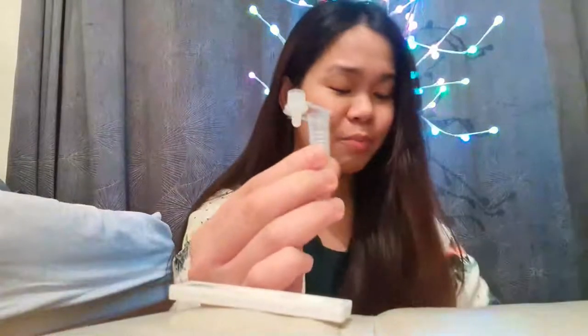Five, six — there you go. You can probably ask someone to hold this for you while you swab yourself, or leave it somewhere safe so it stands up and the solution won't spill, keeping the top bit sterile as much as possible — which I've gotten used to now.